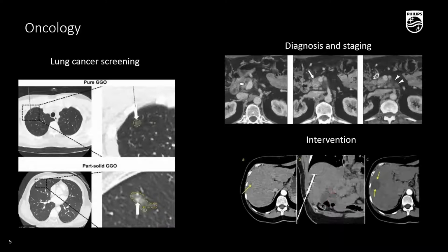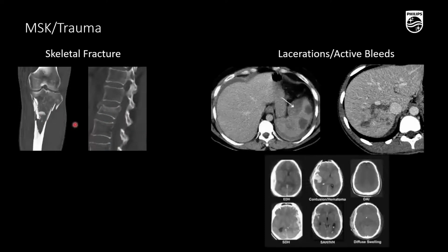the operation. And then I lumped these here together because this is often done, but trauma doesn't necessarily mean MSK, and MSK not necessarily trauma. But in this area, of course, we know that CT is really good at identifying fractures. So characterizing the severity, location of the fracture itself, here again, the spine, where we can see the fracture very well, in the tibia as well.